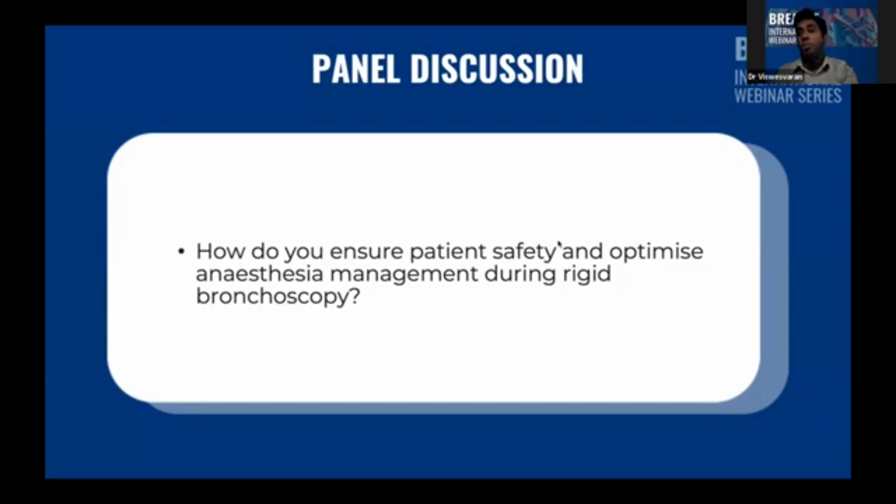and we should not rely entirely on the anesthetist, because most of the time it is a procedure which is new for them, especially with the evolving domain of interventional pulmonology. Regarding the anesthesia aspect, at our center, though there are proponents for giving a sedation alone and intubate and then following a paralysis, what we have observed in most of our cases is we go in for an upfront complete sedation and a paralysis, and then we intubate with a rigid bronchoscopy.